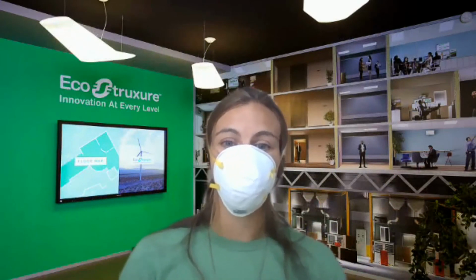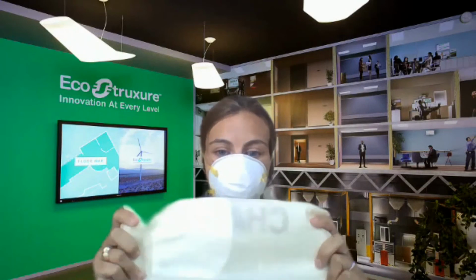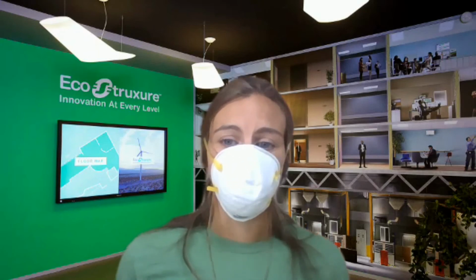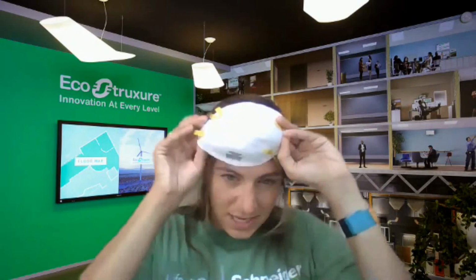Reminder that this is your mask for 5 days, unless soiled, at which point you need to go get a new one. You can store overnight in a moisture wicking bag. Once your 5 days are complete, you can dispose of your mask in common household trash if concealed in a lined container or sealed bag. We don't want the cleaning crew inadvertently exposed, so be vigilant for site-specific procedures regarding disposal.